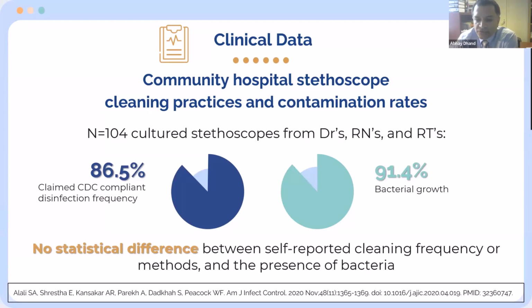And not only that, there is no statistical difference between the self-reported cleaning frequency or methods and the presence of bacteria. So the stethoscopes remain contaminated. So the next slide, please.